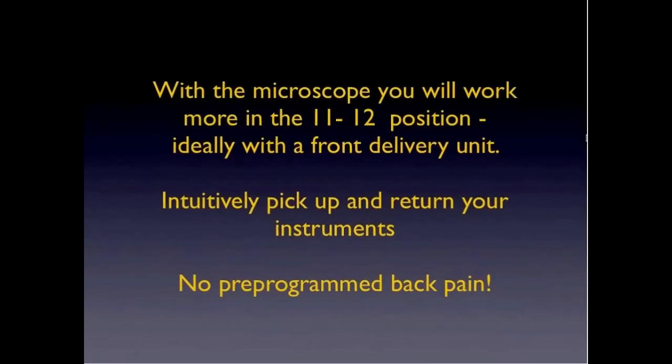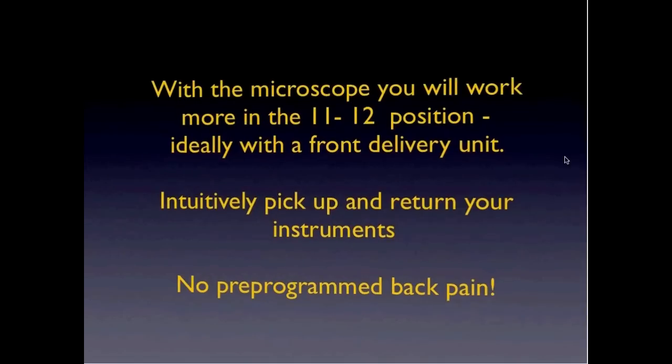With a microscope, you will work a lot more in the 11 to 12 o'clock position, and I love to work with the front delivery unit. You pick up and return your instruments without even having to look at it. Like here.